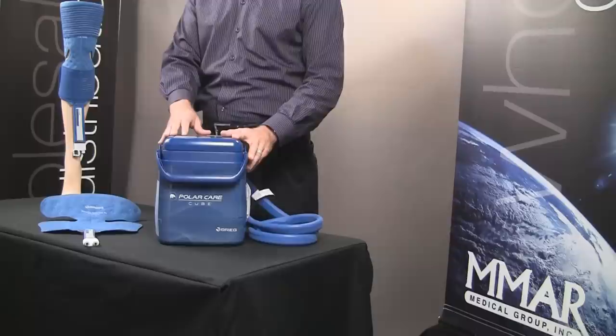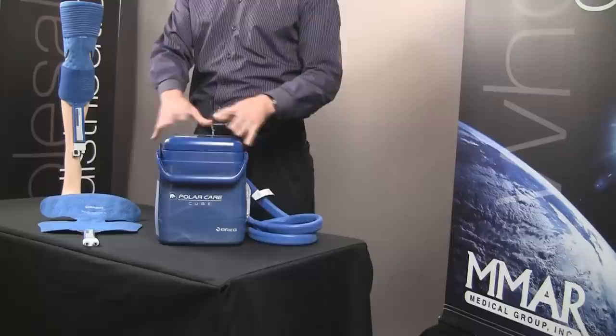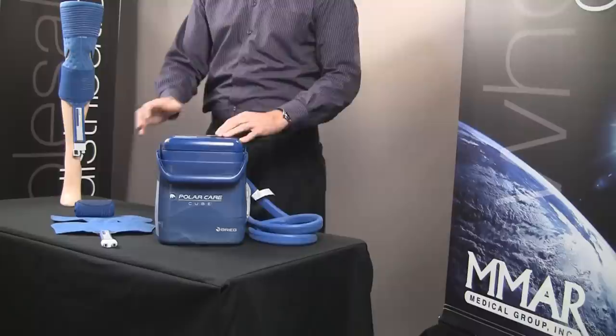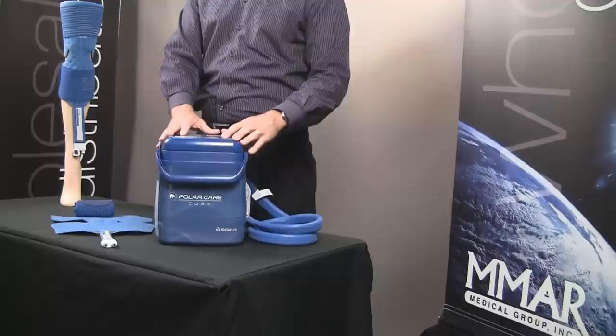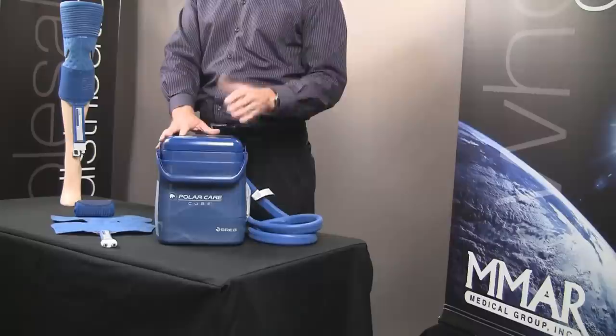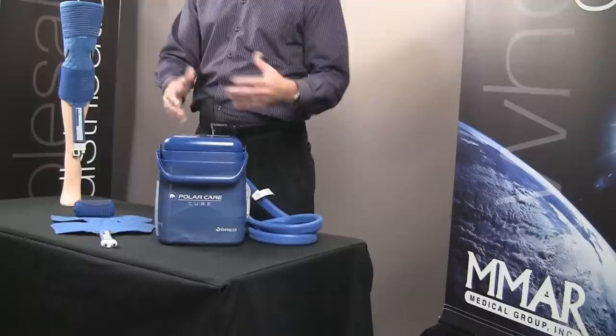Let's talk about cold therapy first and how it works. Every cold therapy unit will have some type of bucket with a hose that's attached to a pad, and these happen to be motorized units. There are also some non-motorized units out there. The idea behind continuous cold therapy is it's going to circulate ice water through the pad for an extended period of time — most of the time three to four hours — which is different from a gel pack or ice pack that typically lasts 20 minutes.